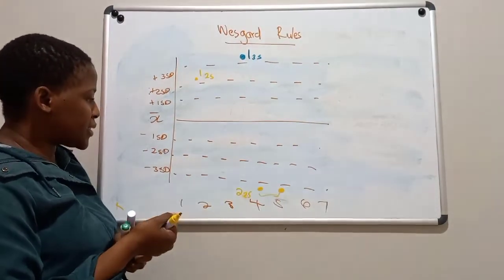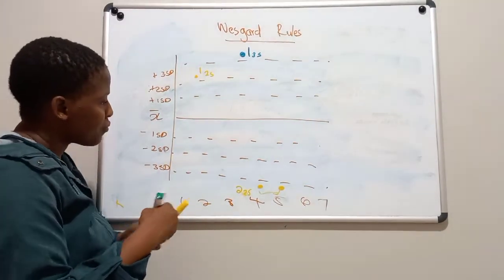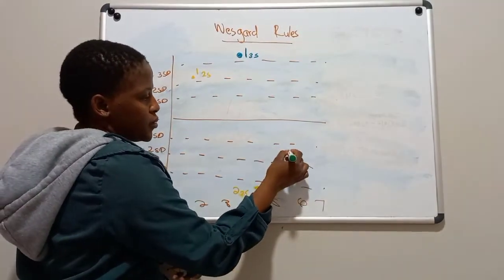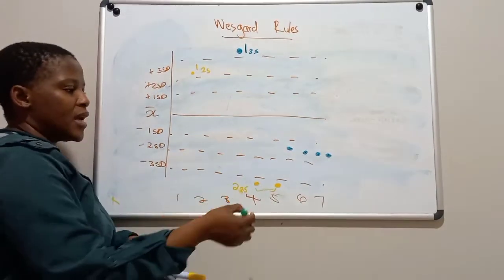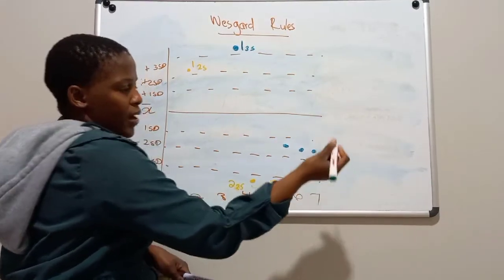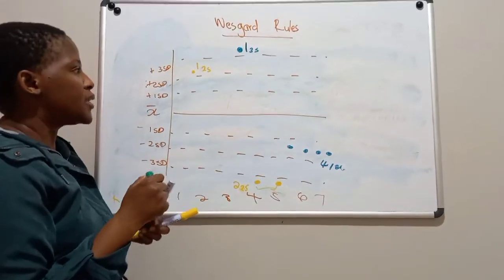And then now let's say you have the 4-1S rule, 4 points outside 1SD. So let's say on the 6th you ran twice, and on the 7th you also ran twice, and then you have 4 consecutive points that are outside the 1SD. So you violated that rule.